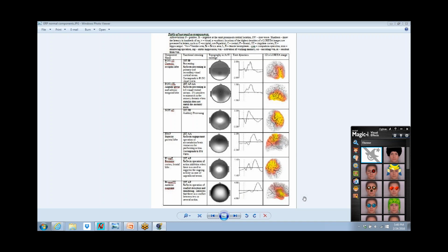Same size, it's now too big. No, it's not. It's too slow. And it will tell you it's too coherent, but it's not. It's just not fast enough. It's comparing this rhythm at 7 that should be at 10, and it's telling us it's too big and too coherent, when that's really bad advice.